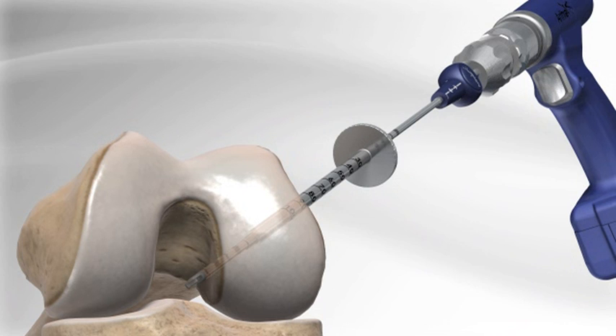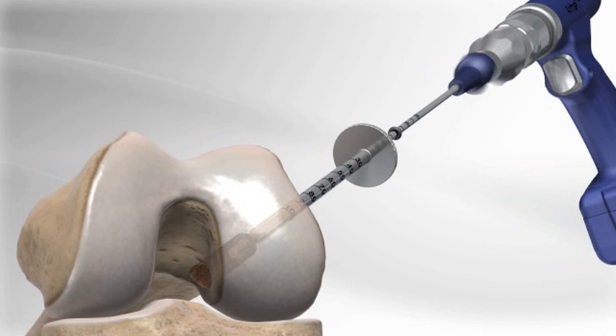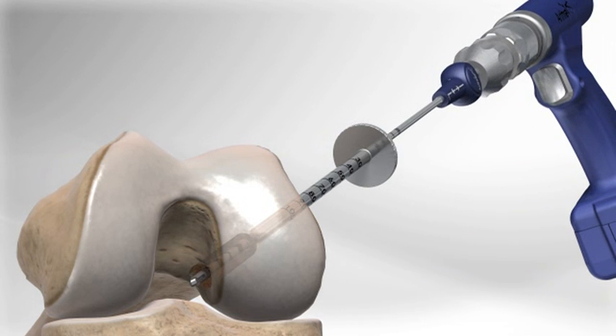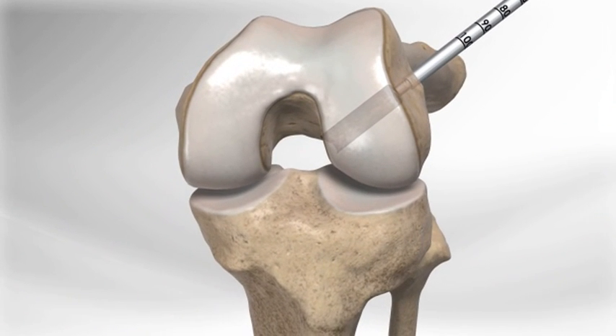By pushing a button on the flip cutter, the tip is rotated into a cutting position. The flip cutter is then drilled back into the bone to create a socket where the graft will eventually be placed. The flip cutter is drilled until it hits the guide, preventing over-drilling. The flip cutter is removed and a suture is passed into the joint and out of the skin for later graft passing.